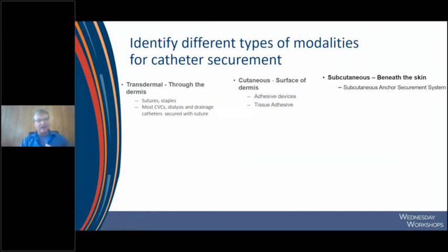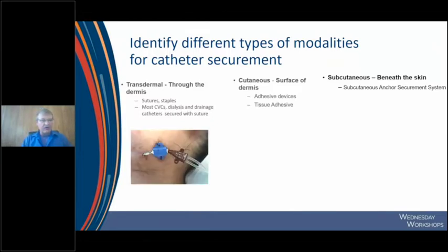When I talk about the modalities of securement, we think of transdermal, cutaneous, and subcutaneous. Transdermal is through the skin. It's the sutures. We see this a lot in dialysis catheters and CVADs, the neck and whatnot. The cutaneous is the adhesive types of devices.